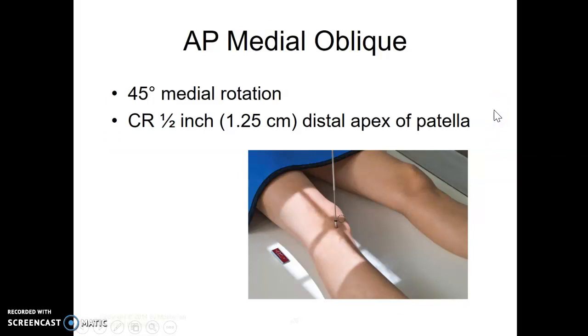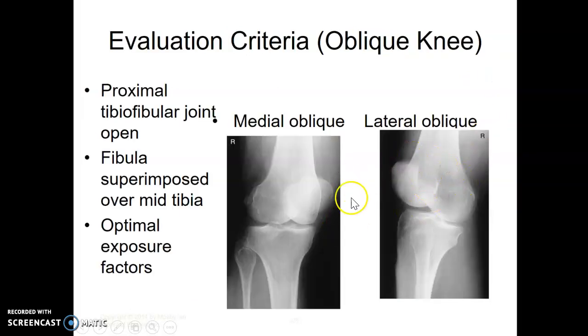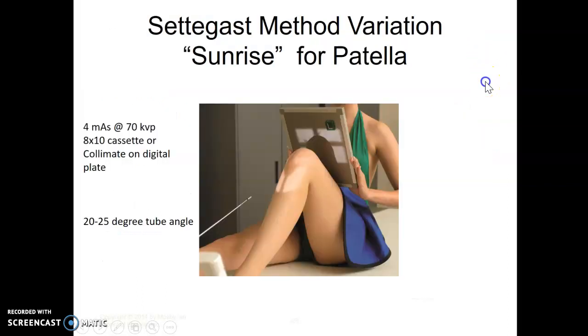Obliques. We don't often do knee obliques at our site, but maybe the off-sites will do them, and they are in your textbook. It's a 45-degree medial rotation, and central ray is the same. It's either medial or lateral obliques, and this is what they'll look like. You can see the patella shifts with it.